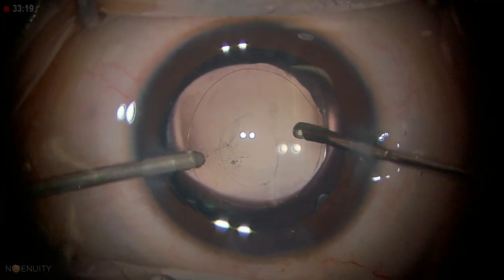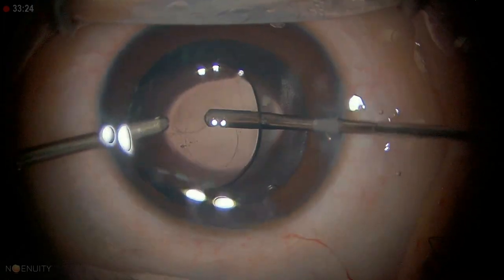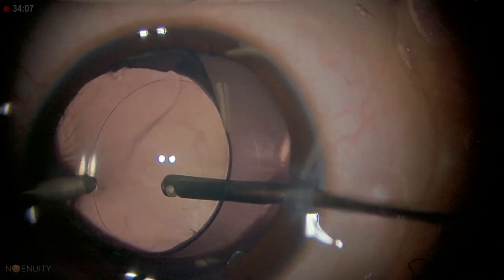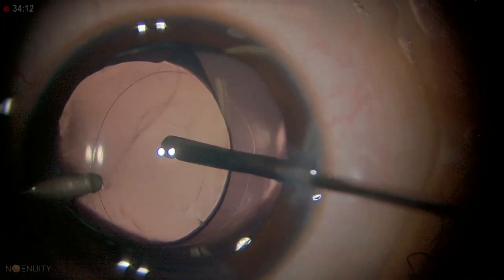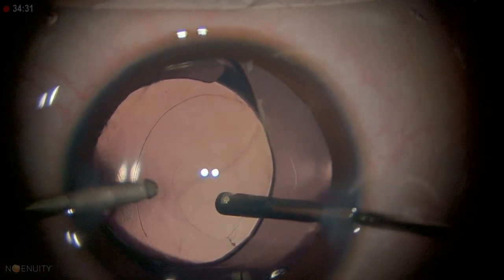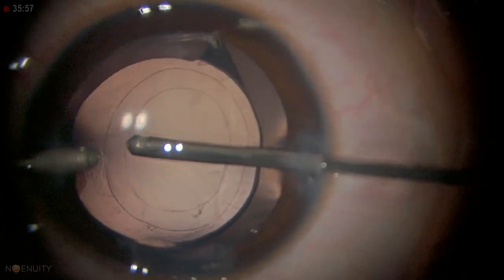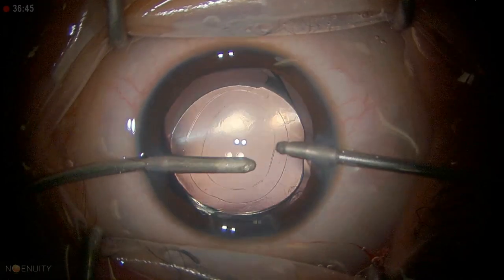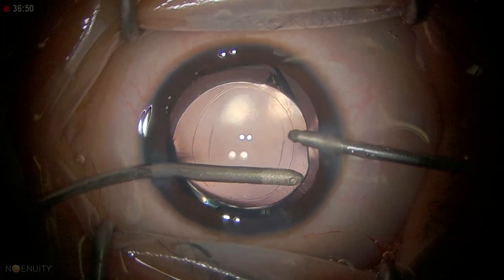You can see I'm just nudging the lens into place and then going behind it. The probe should be directed wherever you want to enlarge — I am enlarging it on this side. There is some viscoelastic remaining so I need to take it out; this is the final step before closing.